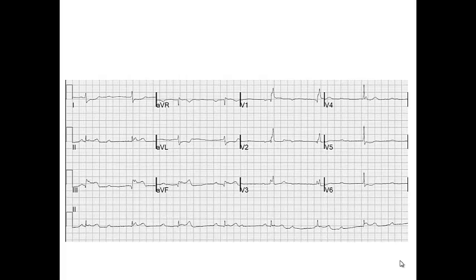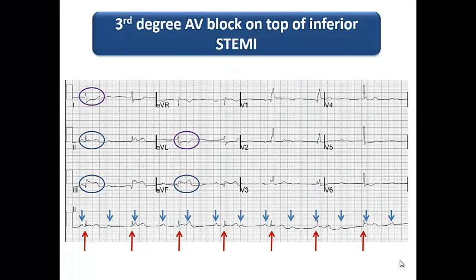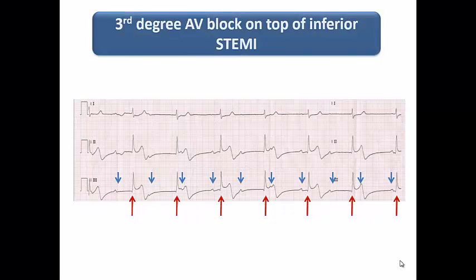Here is an ECG with P waves completely dissociated from the QRS complexes — third degree AV block. A common mistake in the ER is focusing on the striking bradycardia and scheduling a temporary pacemaker, while missing the ST elevation in inferior leads. This patient has third degree AV block on top of inferior STEMI. They do not need a permanent pacemaker; they need revascularization by opening the culprit vessel, after which the complete heart block will resolve. Another ECG also shows complete AV dissociation on top of inferior STEMI.